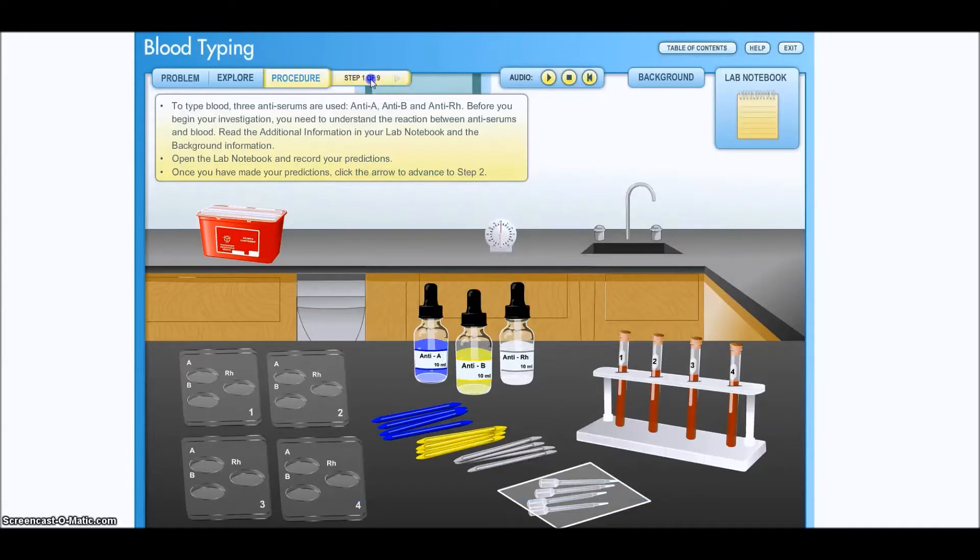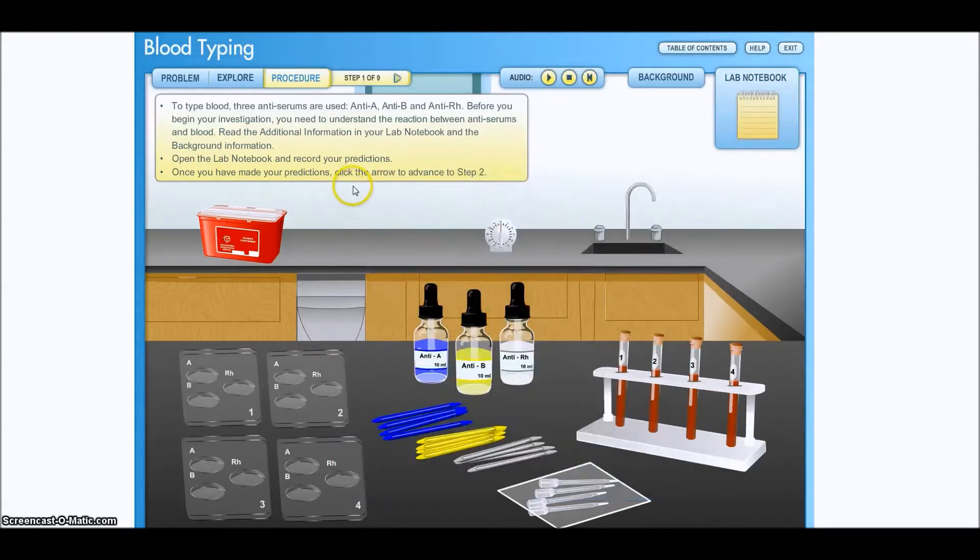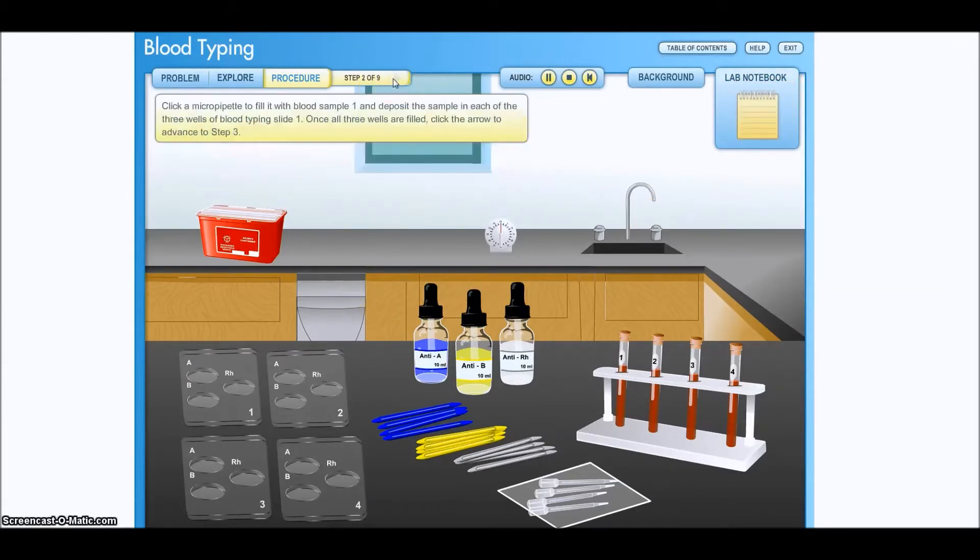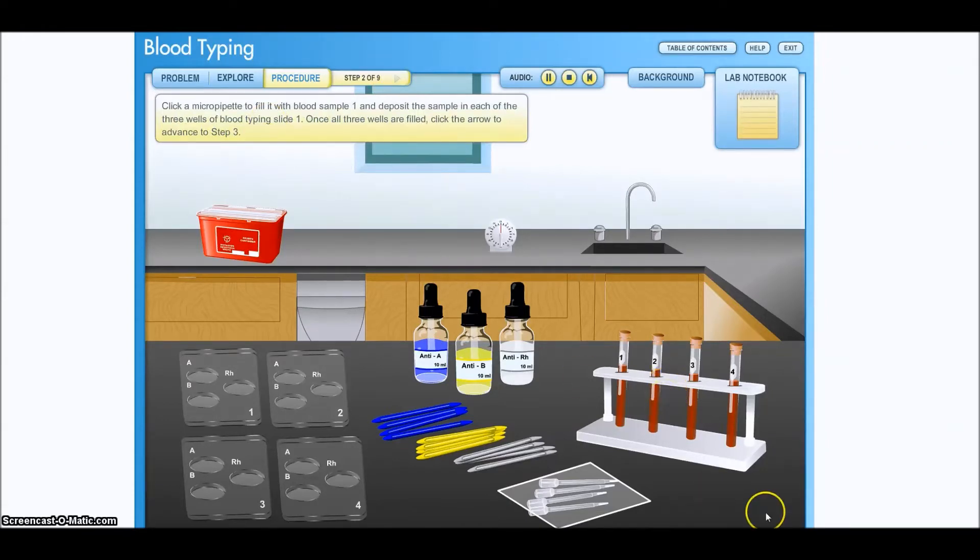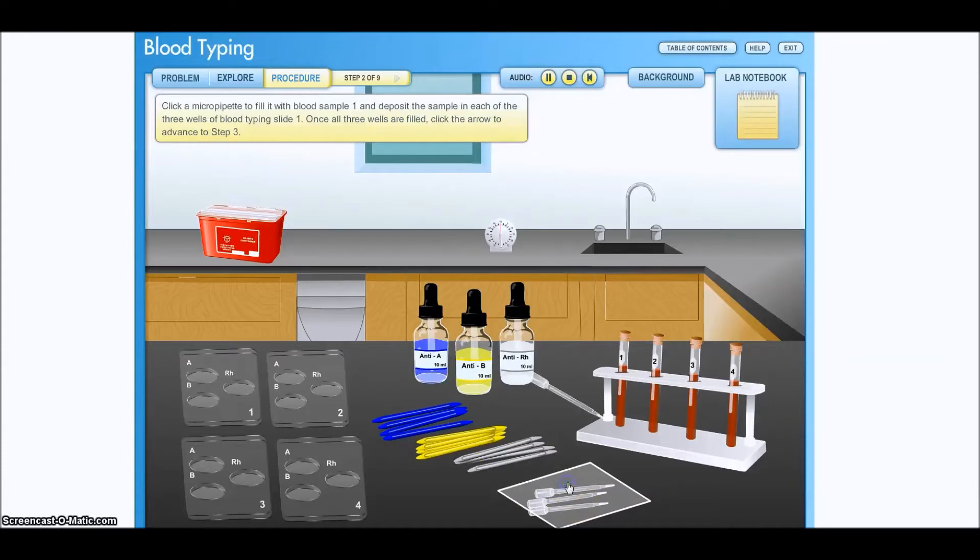Step two of nine. I didn't finish filling out the lab notebook. I had to fill out the lab notebook and click print in order to get this to go on to step two. Click for a pipette to fill it with blood sample one and deposit the sample in each of the three wells of blood typing slide one. Once all three wells are filled, click the arrow to advance to step three.